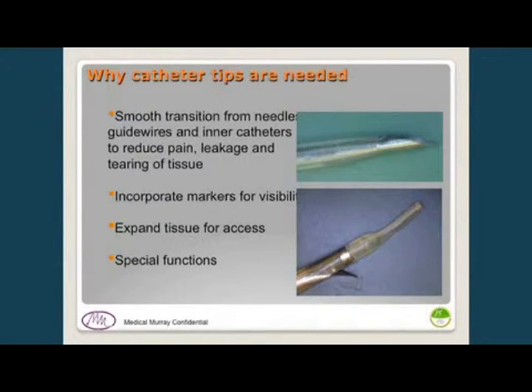There's also a need in many cases to have a very smooth transition. On the upper right-hand side you can see the catheter against the needle. In that case we want it very tapered and to fit very snugly on the needle, so that as it penetrates through the skin it reduces pain going in, and also in some cases to prevent leakage around it so that it's sealed.